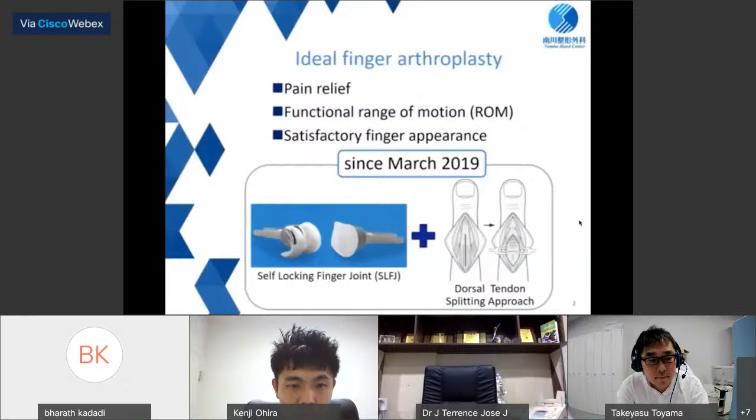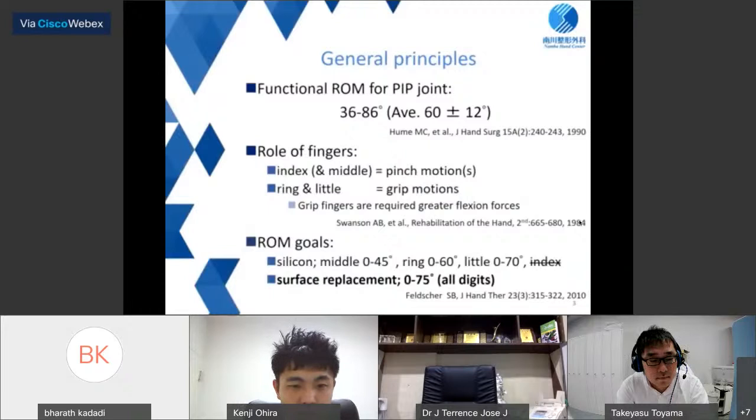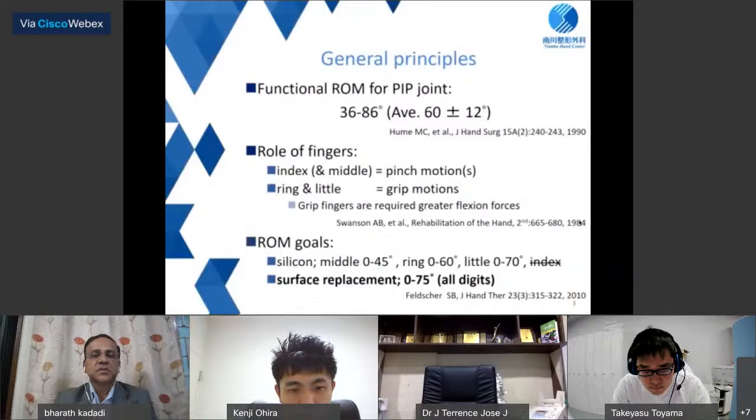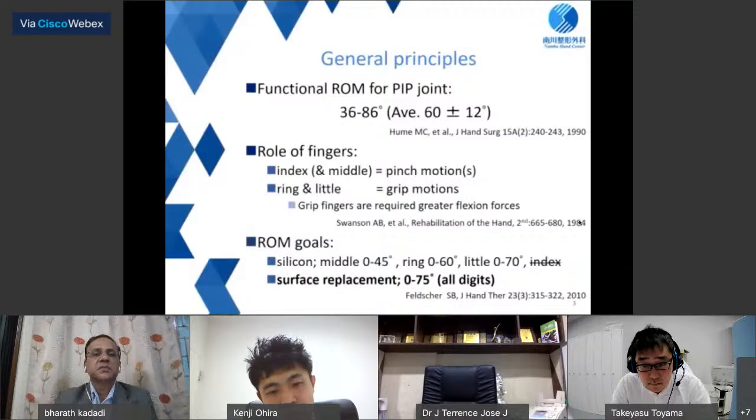This slide shows general principles about finger implant arthroplasty for the PIP joint. Hume et al. reported the functional ROM to be 36 degrees to 86 degrees. Swanson et al. advocated that the index and middle fingers are mainly used for pinch activities, and the ring and little fingers are for grasp activities. Literature compares the Swanson implant and the surface replacement implant. Unlike the Swanson implant, which is not recommended for the index finger, a surface replacement implant can be used for all digits.